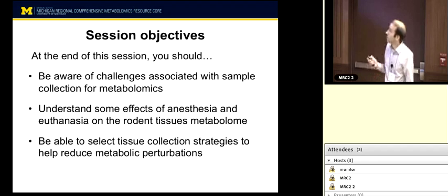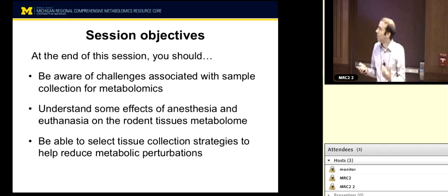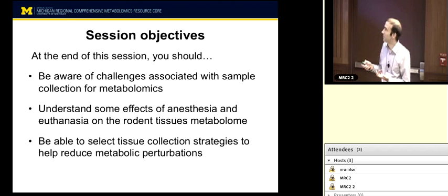Okay, so the purpose of this particular study. Many aspects of sample preparation have been thoroughly studied. When you look at the literature that's out there, people have done to no end studies of the difference between serum and plasma. Maybe that's a question you have: should I collect serum or plasma? What anticoagulant should I use if collecting plasma? My answer to that question, just briefly, is it doesn't make that much difference, serum versus plasma.